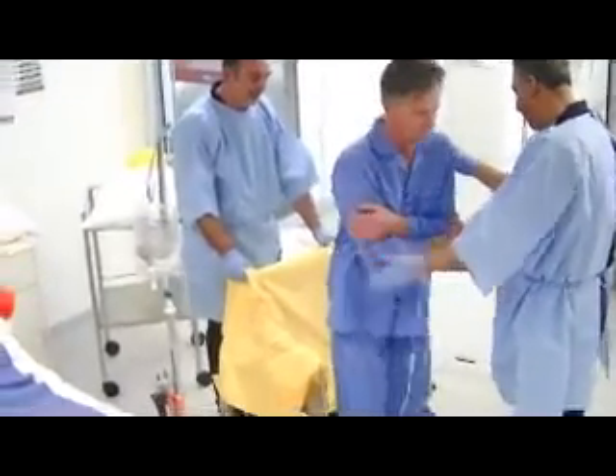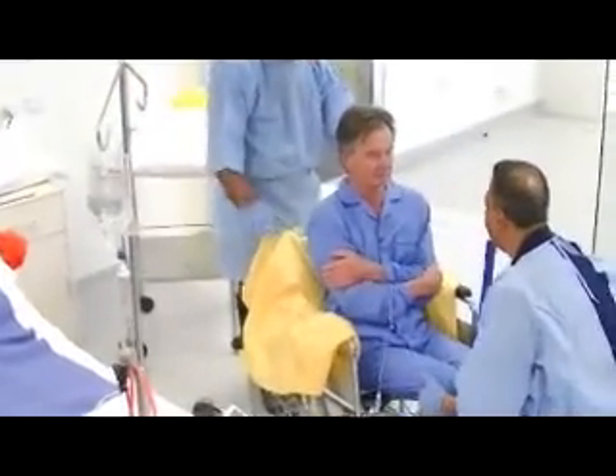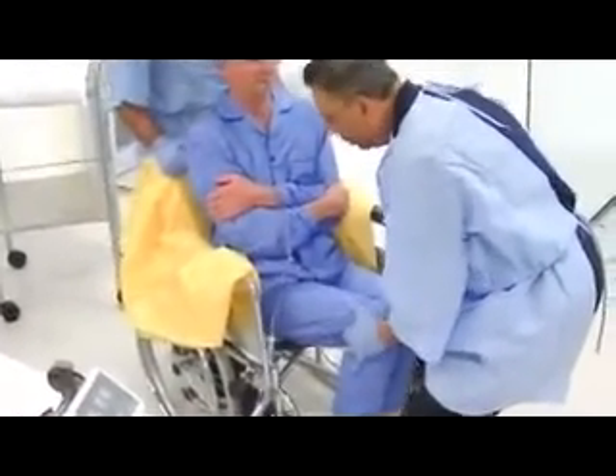The patient takes a seat. I need to get the patient's bottom right back to the back, so I'm just holding onto the top slide sheet, pulling up, and my colleague is pushing from the knee.